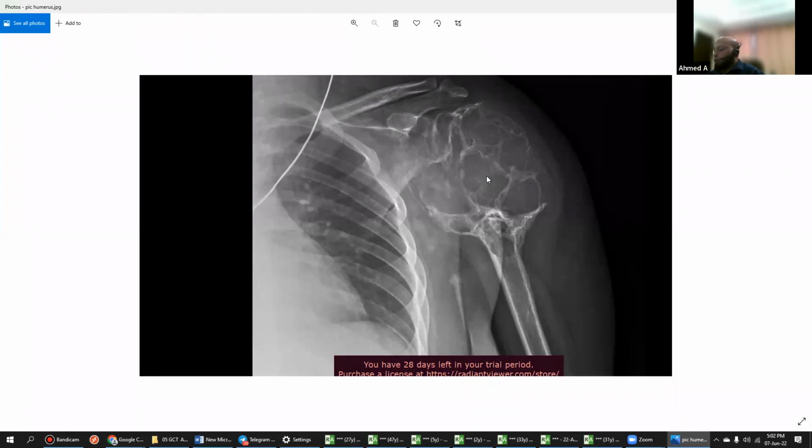And when you're concluding the case, you have to always say where you'll refer, what you will do next. You have to refer this to a bone sarcoma team. Always remember it. Always in your description, in any case of a viva, try to go till the referral part. Even if you have not described it fully, at least you will get points in that. They will see what this person will do with this case. And you can only differentiate this on a biopsy. On an X-ray or an MR, you can say it is an aggressive or non-aggressive lesion, lucent or non-lucent. That's it.